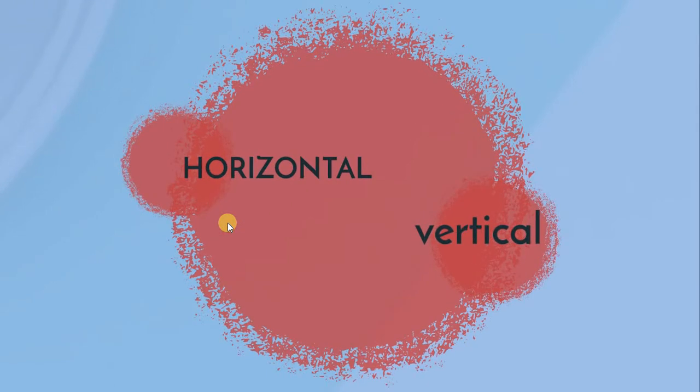For the types of incision while elevating the flap, we have two types: a horizontal incision and a vertical incision.